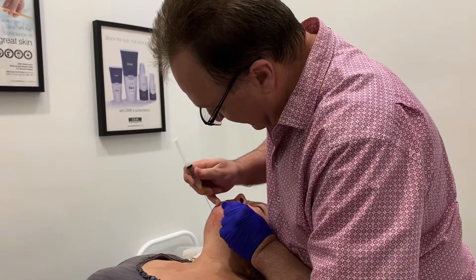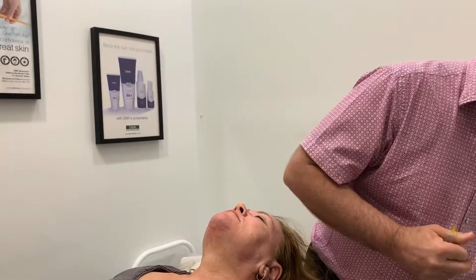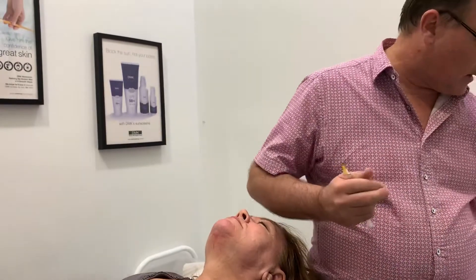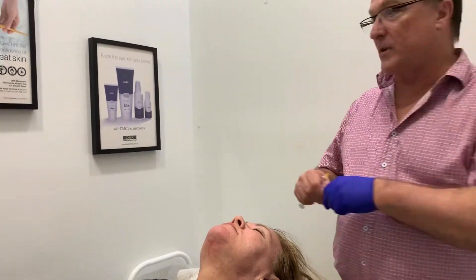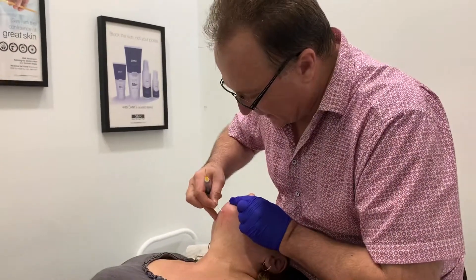I've made an entry point — it's not quite big enough, so I'll make a slightly bigger entry point. There's local anesthetic here, so it's essentially painless.